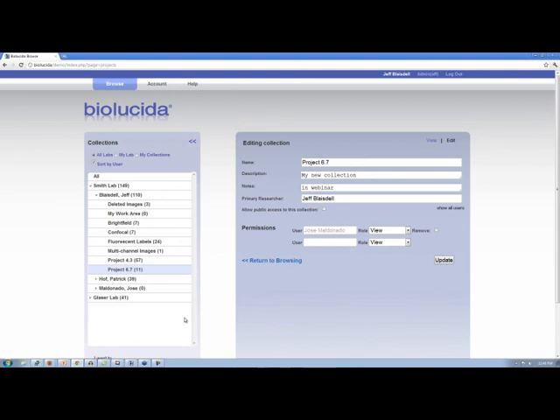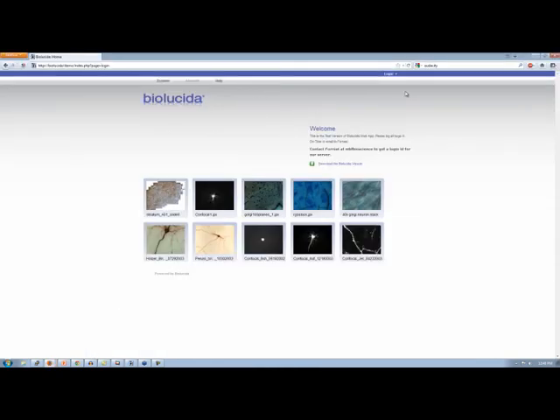And why don't we just show you quickly what that might look like? And I'm actually going to go to Firefox right now to demonstrate this. So just going to open a new, different browser, log in as you to see if I can see that. So right now we're in Firefox. Okay. Let me log in as you. We don't recommend sharing passwords like this. Okay, so now you have logged in.